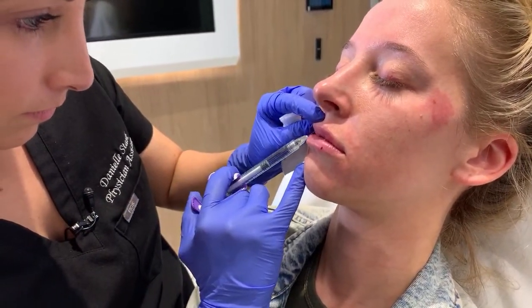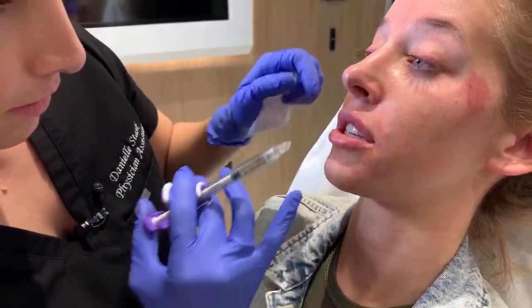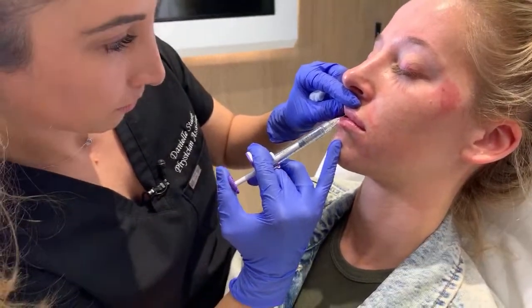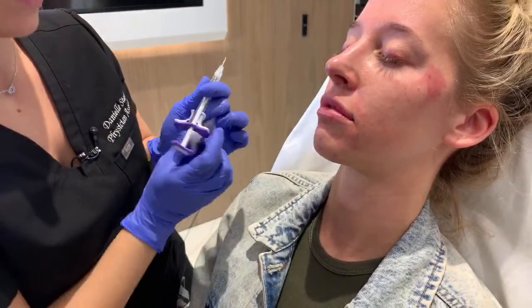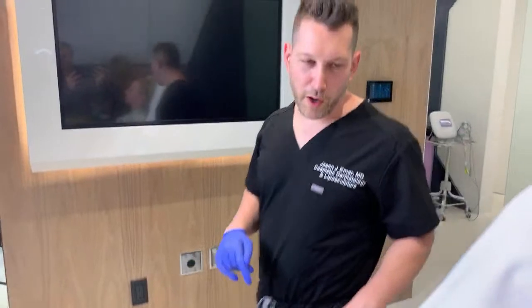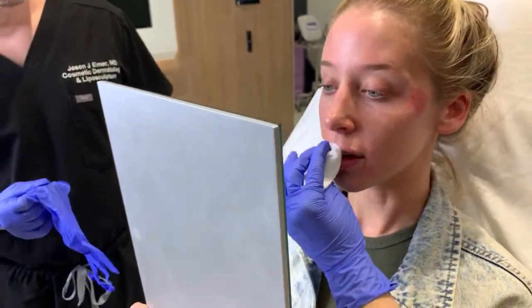Non-surgical nose jobs last typically about 6 months to a year. But after about 2 to 4 weeks, it takes a little bit more than just the syringe, usually little touch-ups. The filler she's getting done today would typically also last up to a year, but often when you have chiseling and contouring, at about 3 to 6 months you notice it going down a little bit, and people do little tweaks here or there.